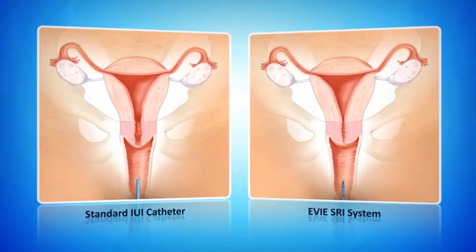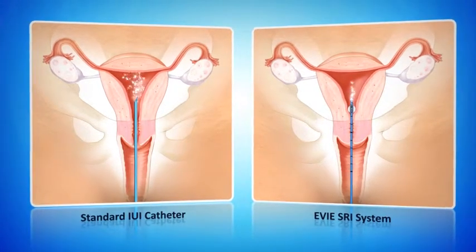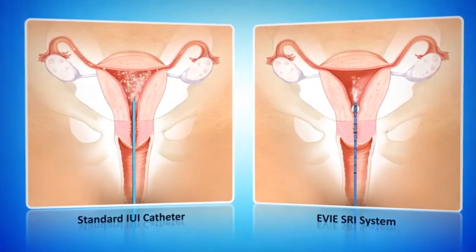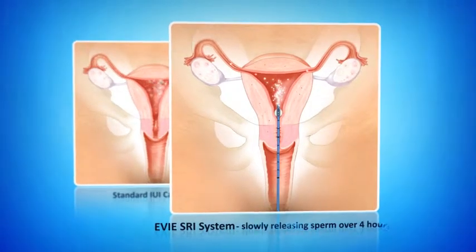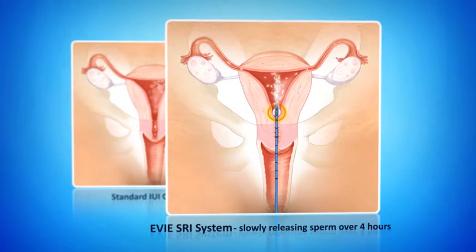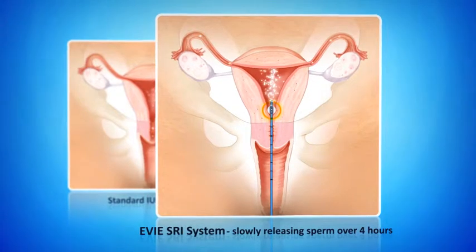Slow-release insemination, or SRI, has been shown to enhance conception rates compared with the standard IUI method. This method mimics the natural conception mechanism by slowly releasing sperm over 4 hours. This appears to maximize the opportunity for conception to occur.